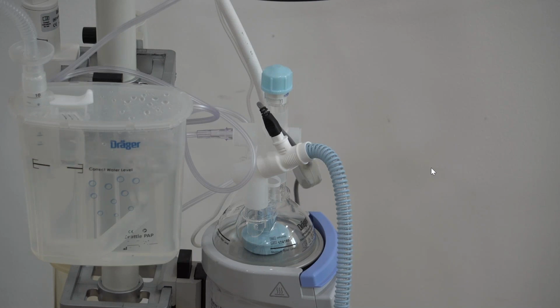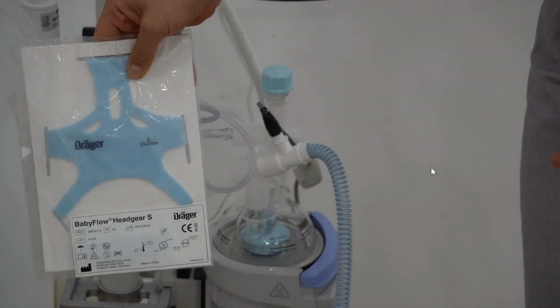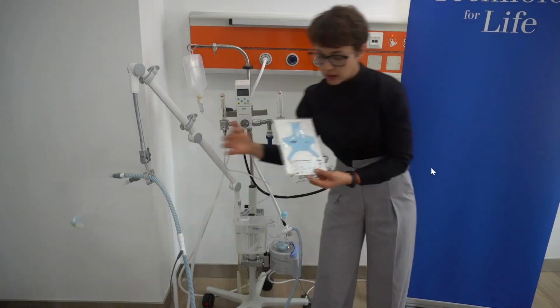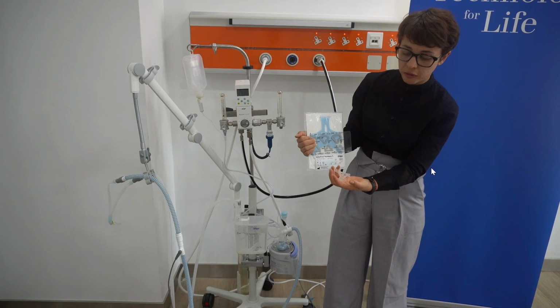Okay, the next question: what is the name of the mask you talked about towards the end of the demo? Is it silicone-based? Is it commercially available as part of the accessories? Yes. The name of the mask, and I can show it to you, is Baby Flow. It is commercially available, as a set, so you can order the mask and the headgear. It comes together with a measurement tape and the different sizes of the mask.